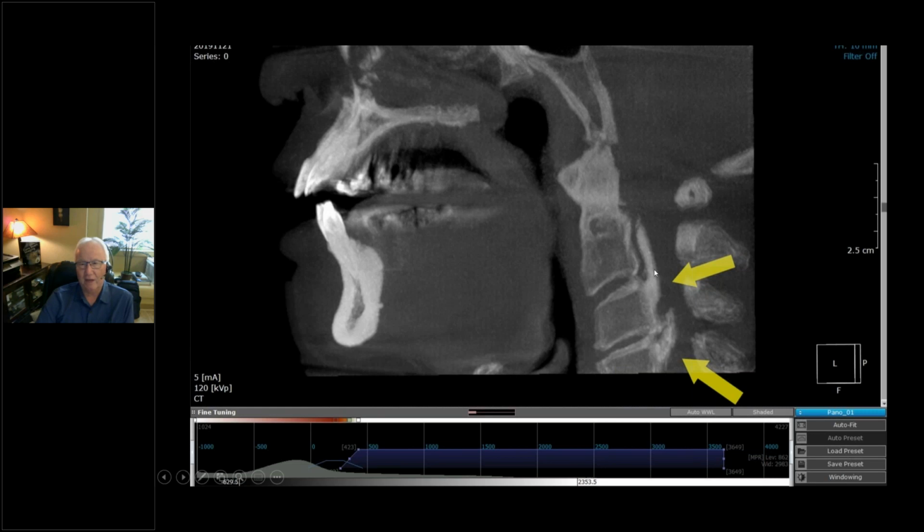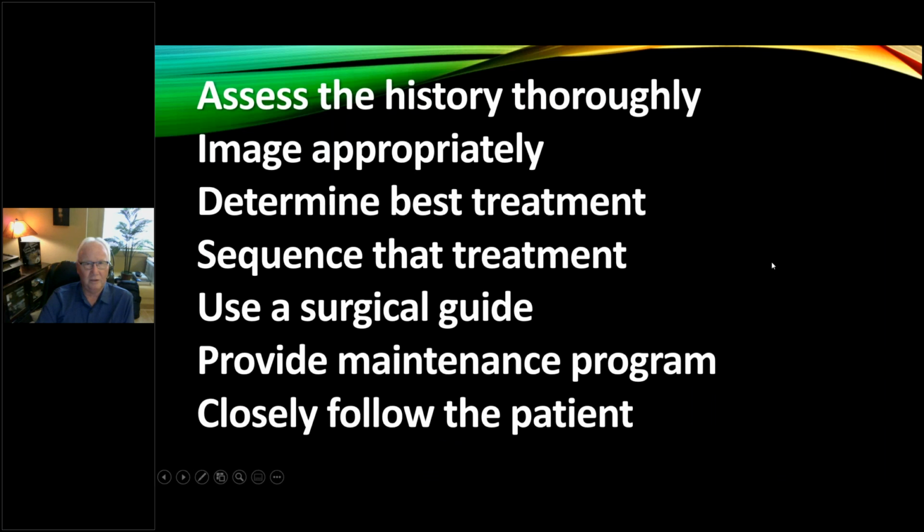And it's quite a common finding. You can find it anterior and posterior, but don't be alarmed. This is a MIP image. When you do some of these images, certain things pop out and you go, OMG, what is this? Well, it's an I-don't-know-oma. Okay, if you don't know what it is, it means you get a referral. So we have lots of my colleagues out there ready to accept your referrals.